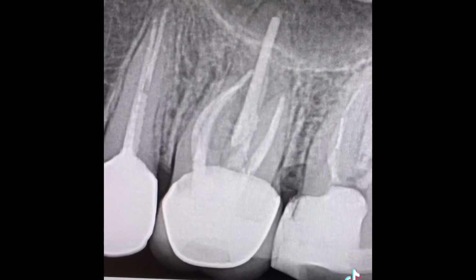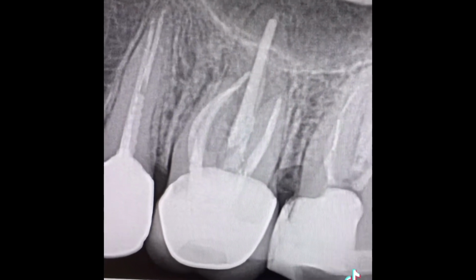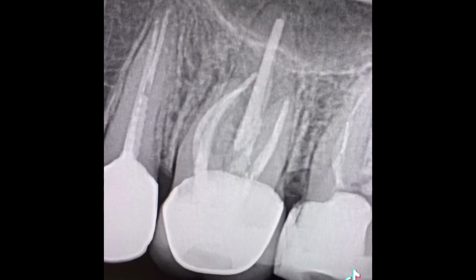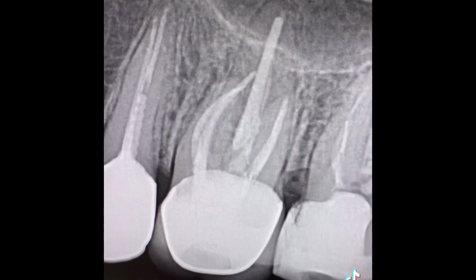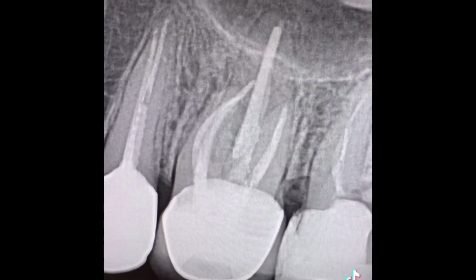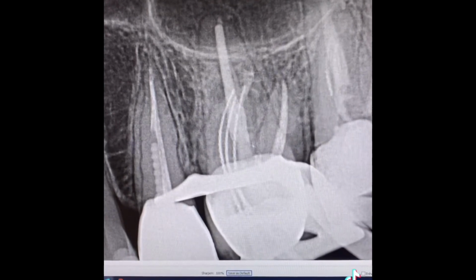Once the root canal was done in Azerbaijan a few years ago, the root canal was redone by an endodontist in San Francisco, and now we were going to redo that root canal for her. It would be the 3rd time. So today I went through the previous endo access and removed all the gutta percha from the mesial root.